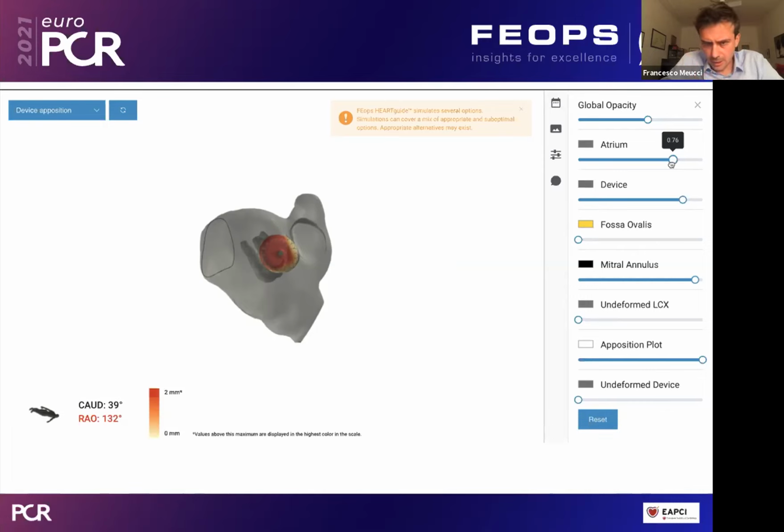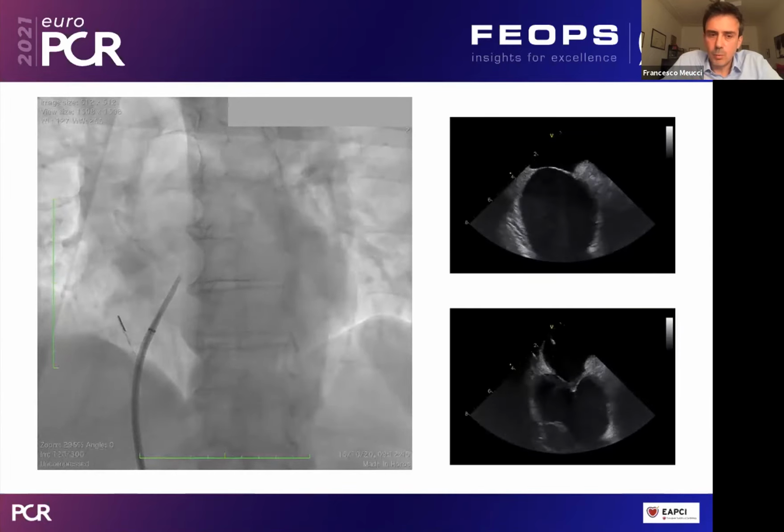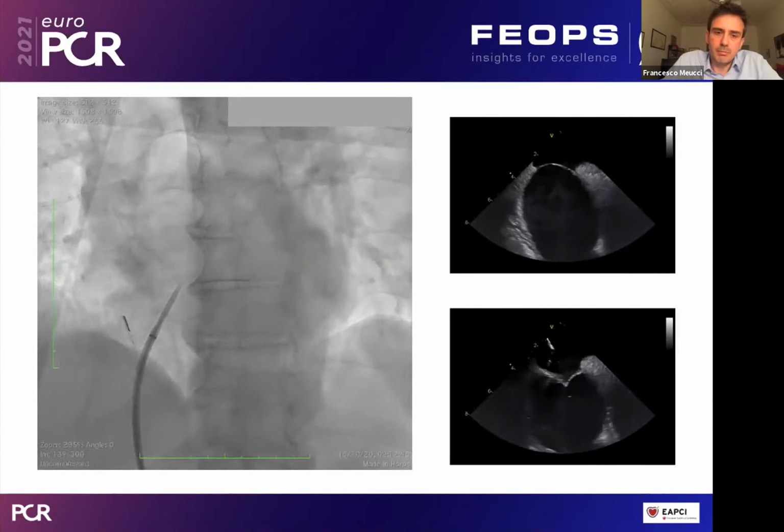And I think going in the cath lab, doing a procedure that is not in my hands, in our cath lab, the most experienced procedure with a nice monitoring without our usual transesophageal monitoring gives you a comfort of concentrating on the maneuvers and on the safety of everything without having the problem of where positioning the device, which device to choose, because you can be quite sure you have to position a 27 millimeter flex a little bit deep inside this appendage. This is the video. These are the videos of the maneuver.